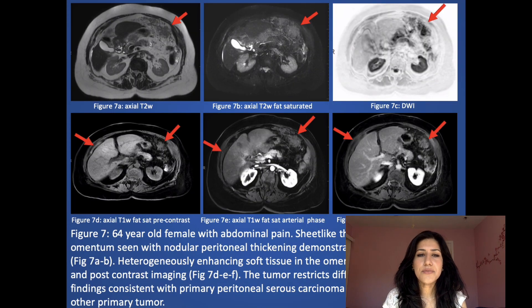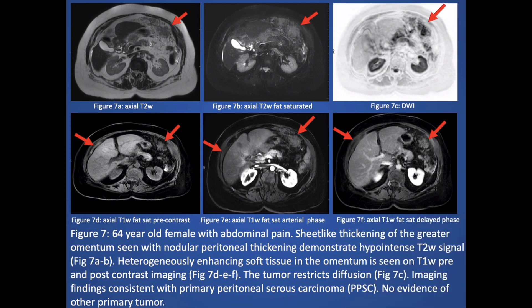Here is a 64-year-old female with abdominal pain. Using arrows to help identify the findings: there is sheet-like thickening of the greater omentum with nodular peritoneal thickening. There is heterogeneously enhancing soft tissue on the dynamic post-contrast images. The tumor also restricts diffusion on the DWI sequence. These findings are consistent with primary peritoneal serous carcinoma, with no evidence of another primary tumor.